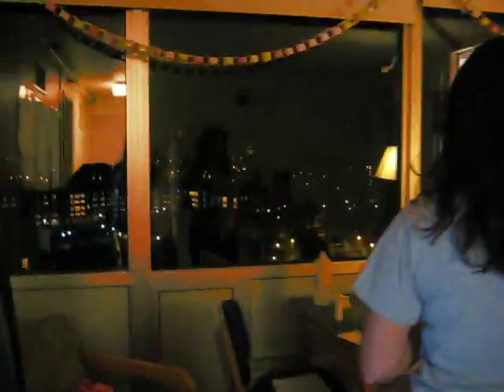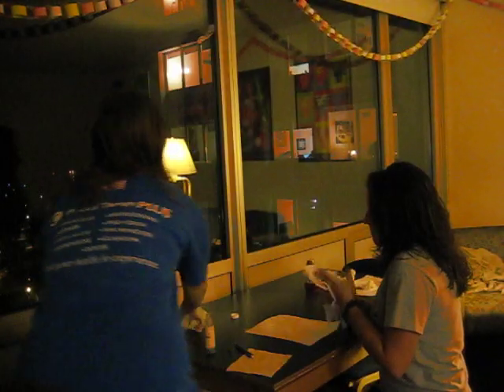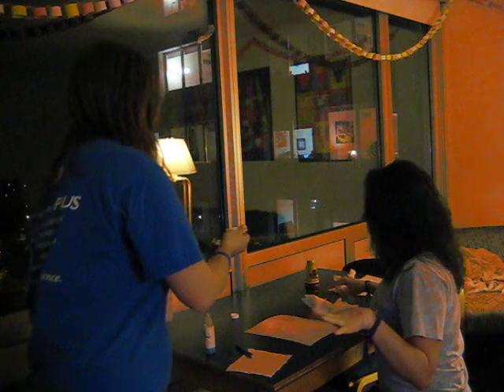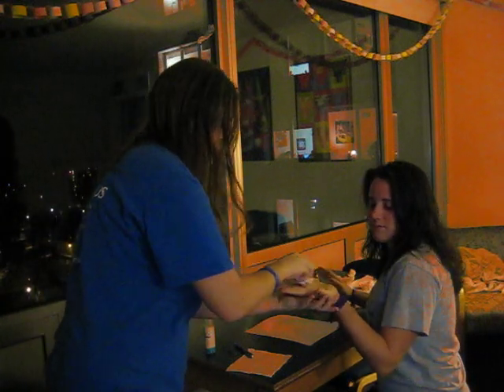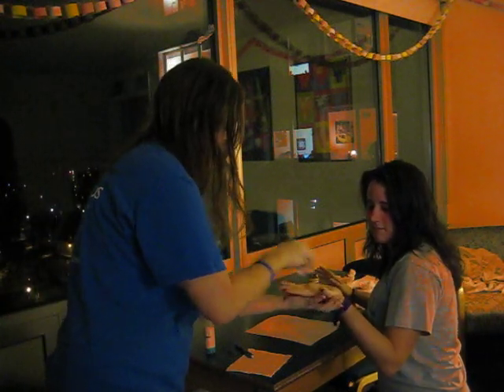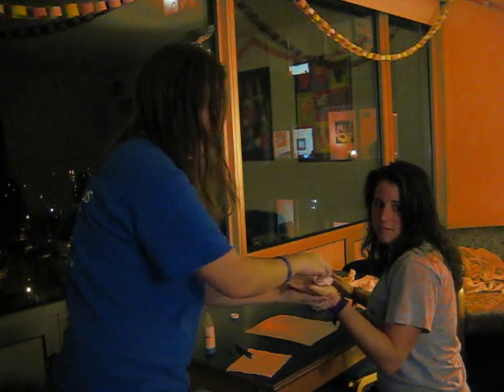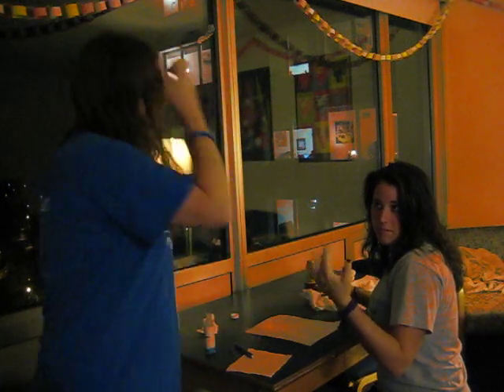We now want the athlete to dry their hands thoroughly to remove all liquid. After the liquid has been removed, we want to rub each fingertip and palm with rubbing alcohol. The purpose of this is to make sure that all the perspiration has been removed from the hand.